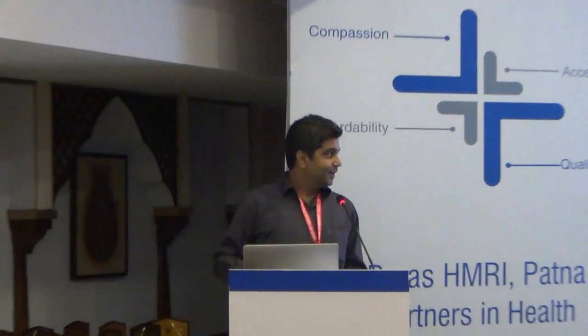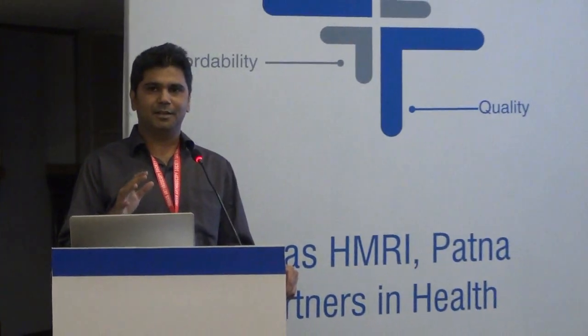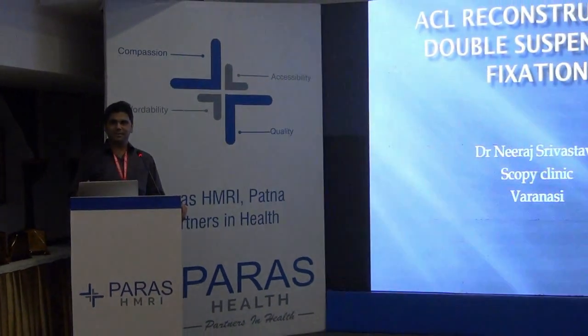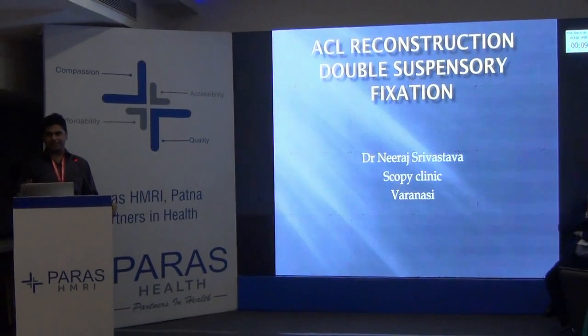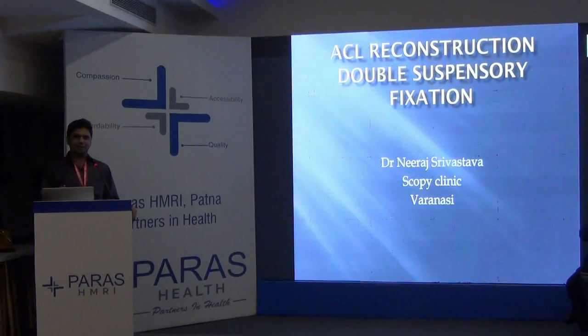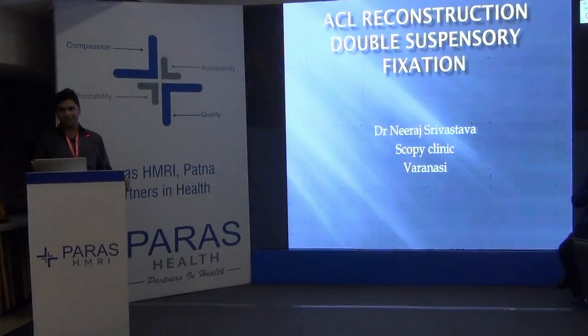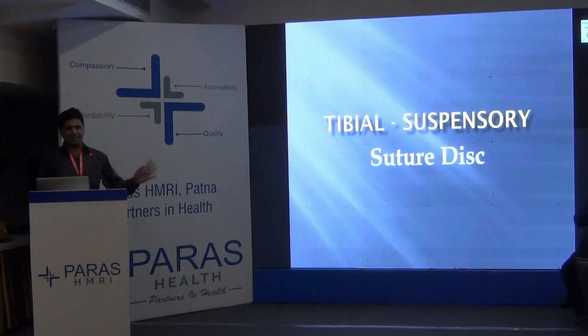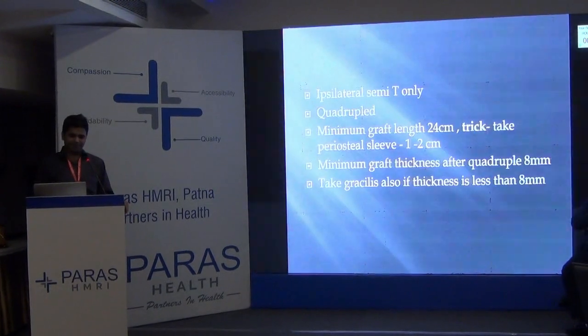Hello everyone. So we had enough talk about how to do an ACL reconstruction. So I am just presenting a normal ACL reconstruction with a different kind of fixation device. Classically everybody is using a screw on the tibial side. I have been using a suture disc on the tibial side. So I am just going to present how to use a suture disc and why to use a suture disc. So tibial suspensory suture disc, and the rest is all the same as it was presented before.